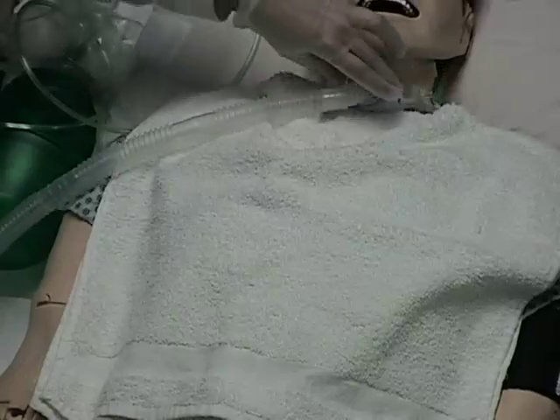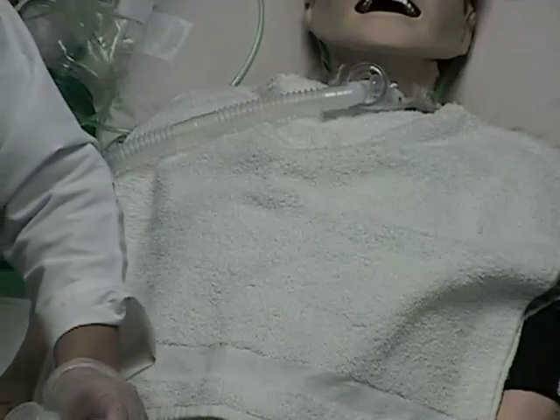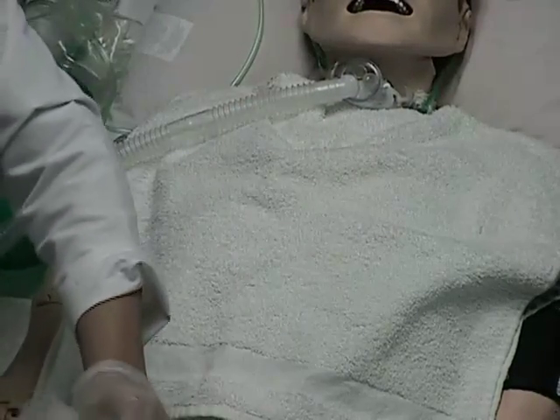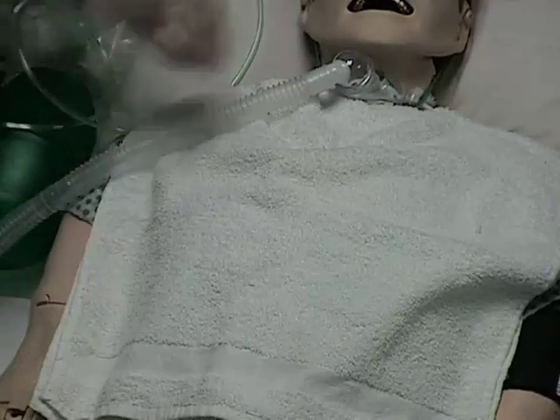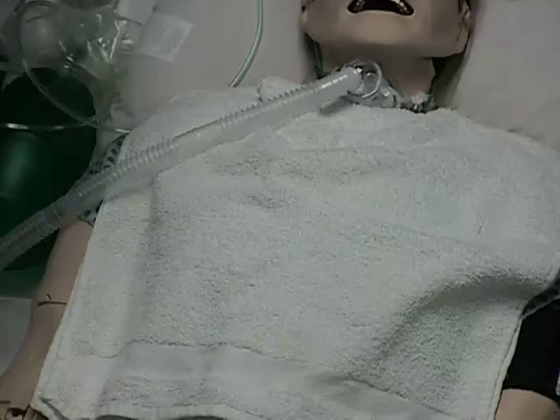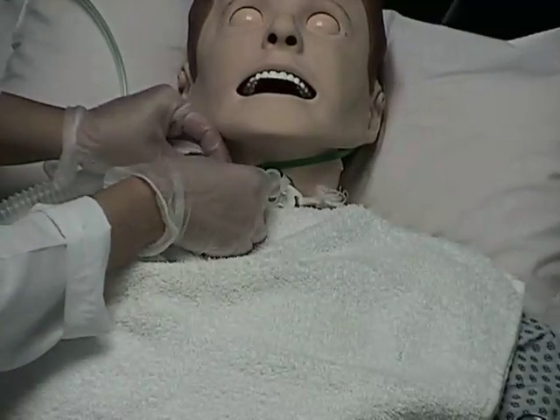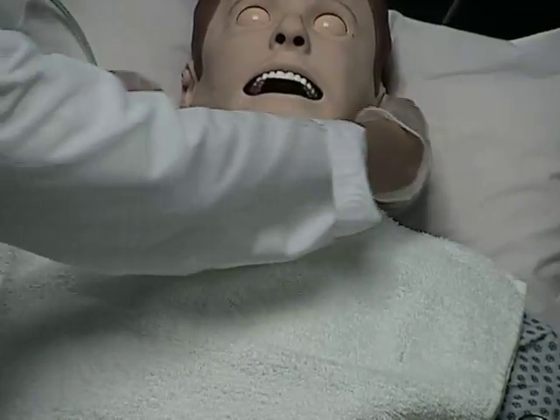After cleaning underneath and over the faceplate, you are ready to replace the trach ties. During this time, it is important to assess the patient for any respiratory distress.